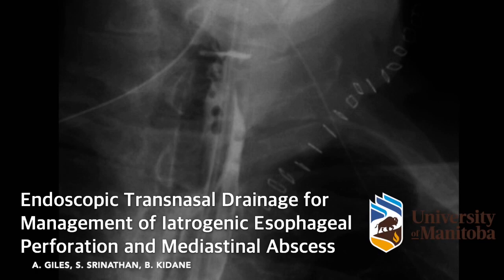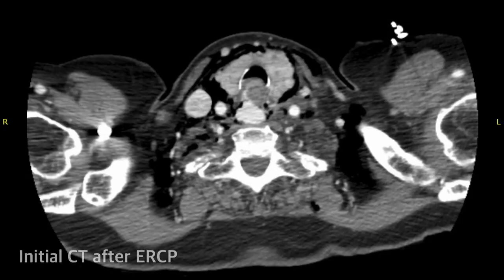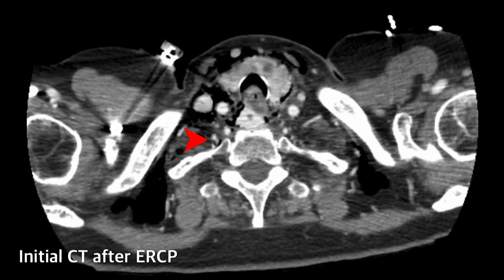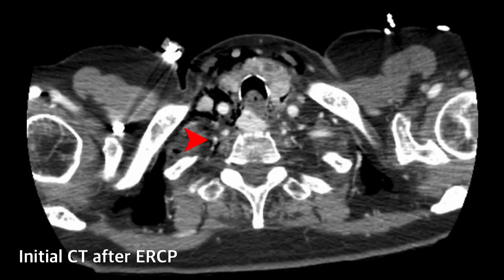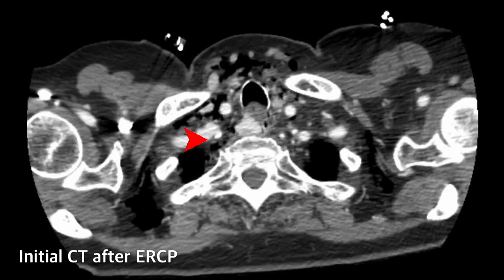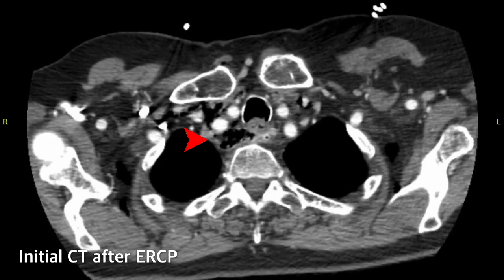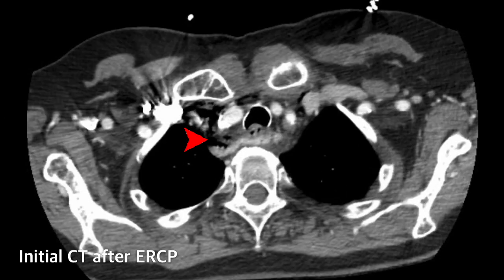In this video, we present the case of an 82-year-old woman who underwent elective ERCP complicated by perforation of the proximal esophagus. CT confirmed a leak into the superior posterior mediastinum.